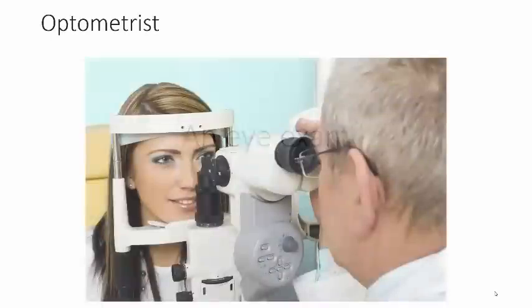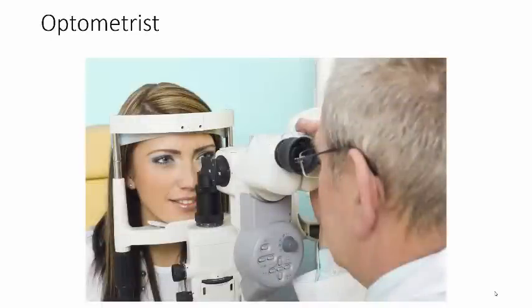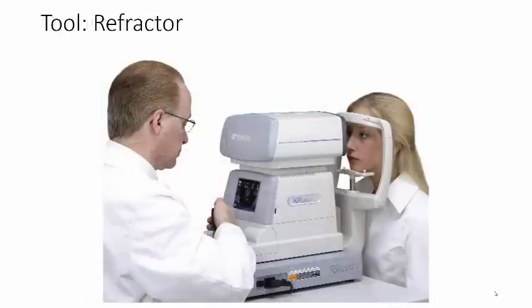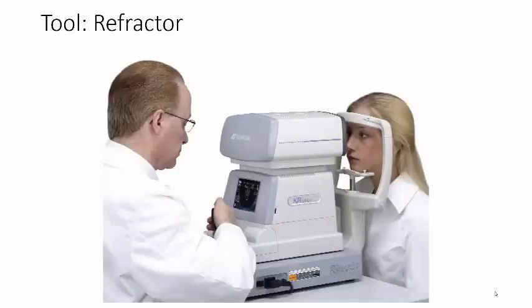An eye exam is typically performed by a medical doctor known as an optometrist. The optometrist uses various diagnostic tools. One tool is a refractor, which measures various aspects of the eyes.